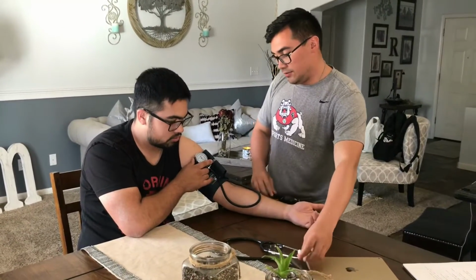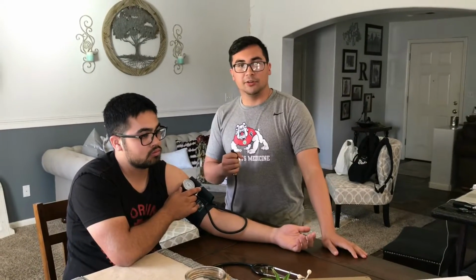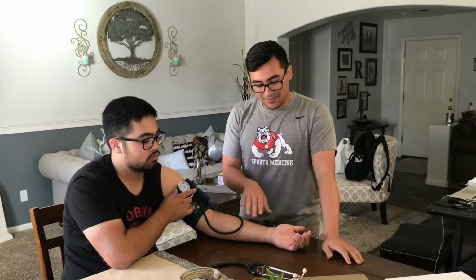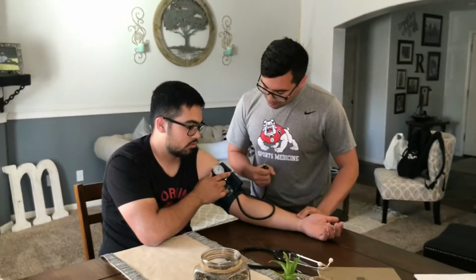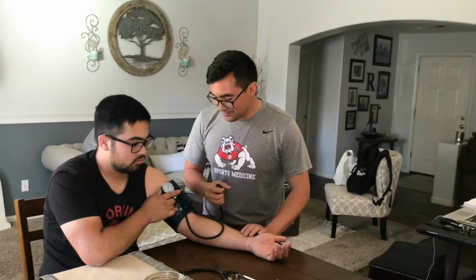First thing I'm going to do is make sure I look out for the auscultatory gap. We're going to pump him up all the way until I cannot feel his radial pulse anymore. So let's just pump my boy up. Oh, make sure it's closed. It's a good idea.